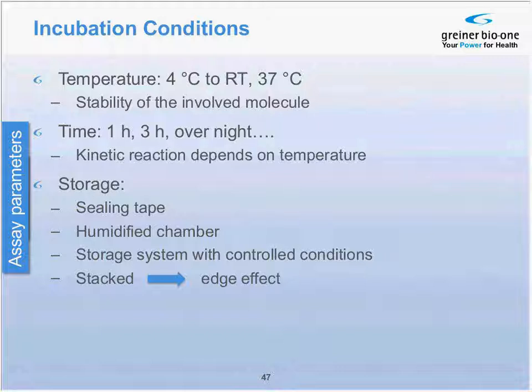Naturally, the incubation temperature has influence on incubation time. The lower the temperature, the longer the time required to reach an equilibrium. The incubation times range, in dependence of temperature, from one hour to overnight.